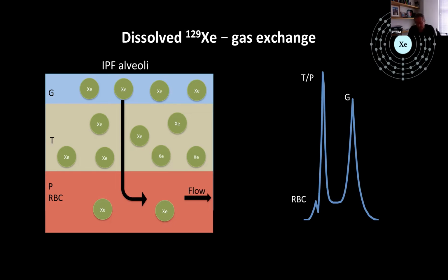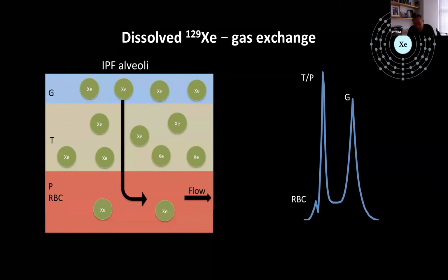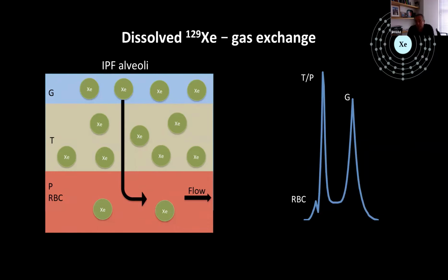So using these four methods essentially, we've got the structural imaging with proton MRI, then the contrast-enhanced perfusion imaging from gadolinium-enhanced proton MRI, then we've got xenon ventilation imaging, xenon microstructural imaging with the diffusion weighting, and then dissolved-phase xenon imaging using this spectroscopic imaging approach to really try and understand the pathophysiology of what's going on in COVID patients.